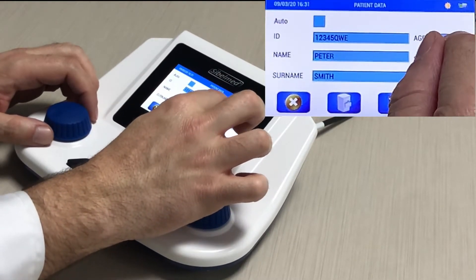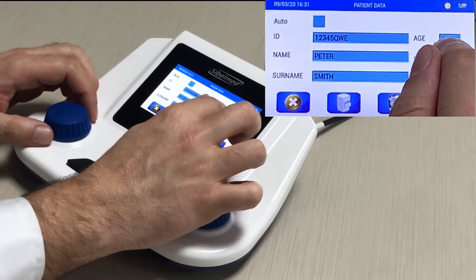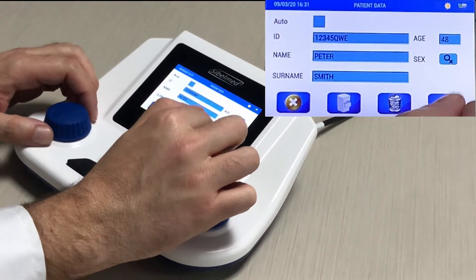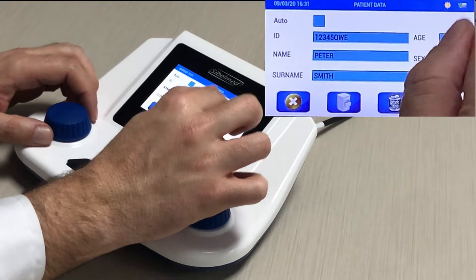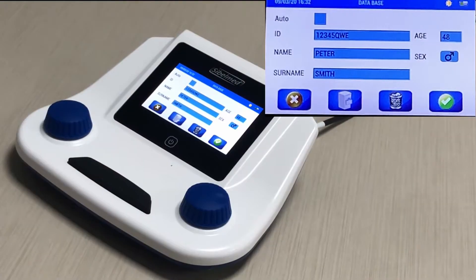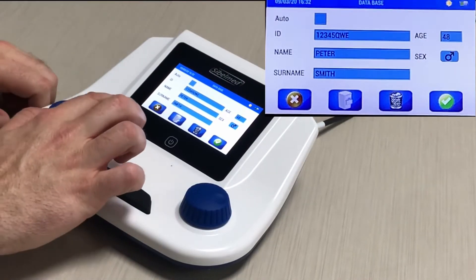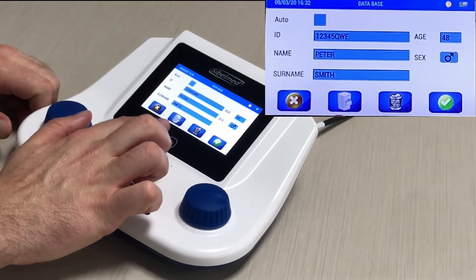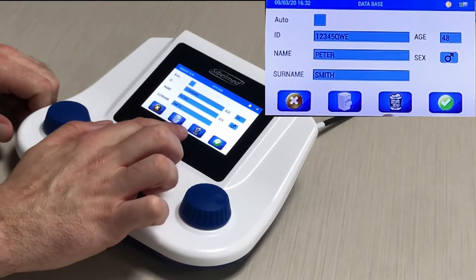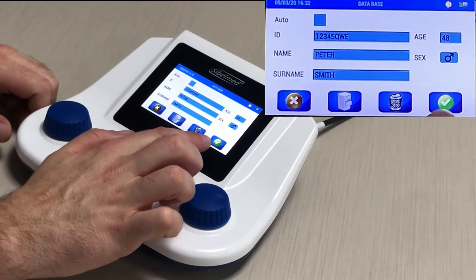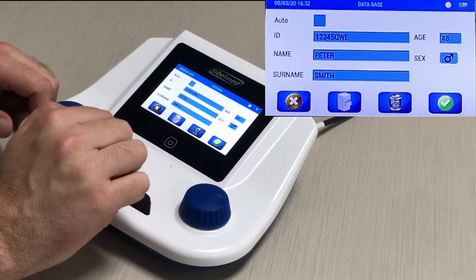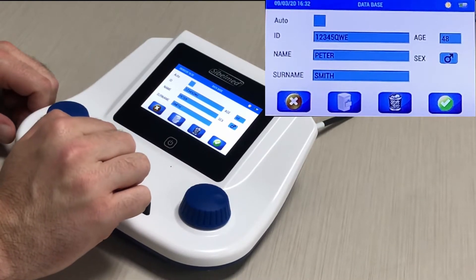If you want to enable some automatic diagnostic calculations, the device includes those. This icon allows you to select a patient from the database. You can also delete the patient file by pressing the paper bin icon.